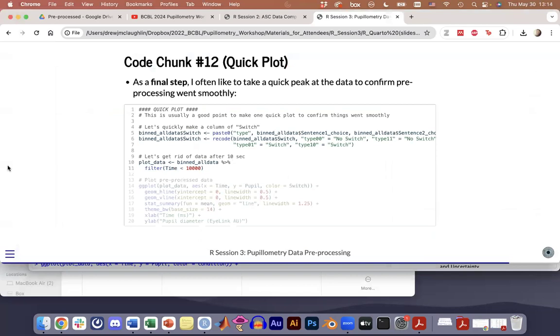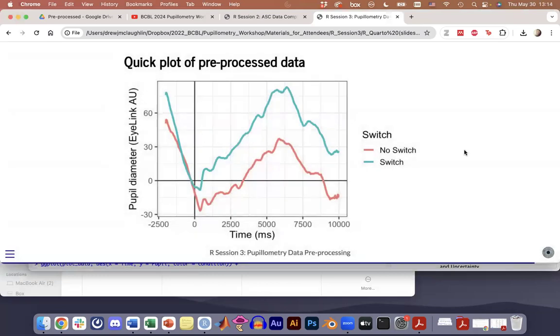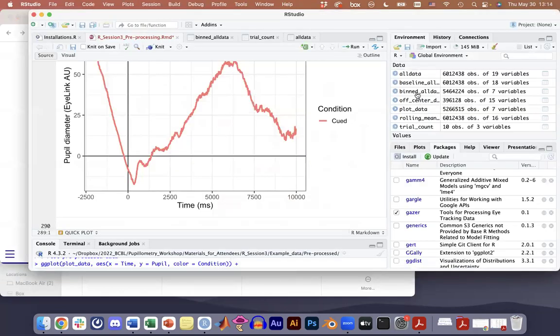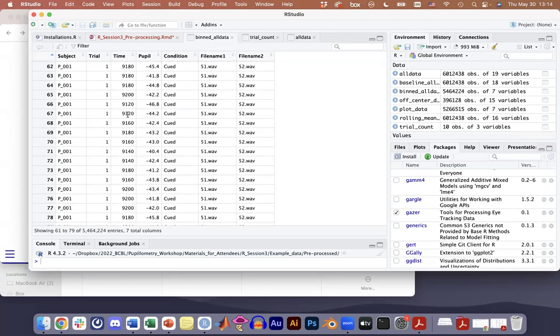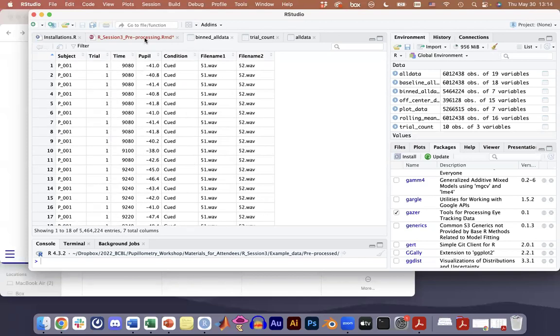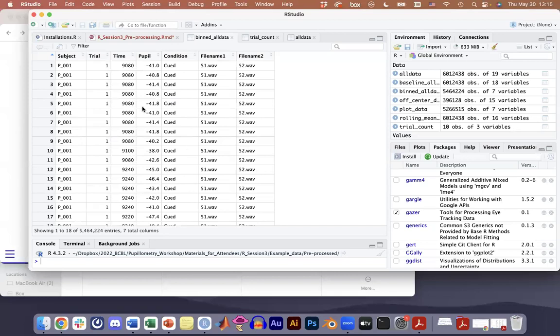I can see it on your face that you want to ask a question. No, it's good. I have a question regarding, right, okay, so I don't know why in my head it makes sense. It's like 9,080, and then it goes 9,000, and then 9,000 again. And in my head, this number means that it's one beam, right? Yeah. So they should be blocked.